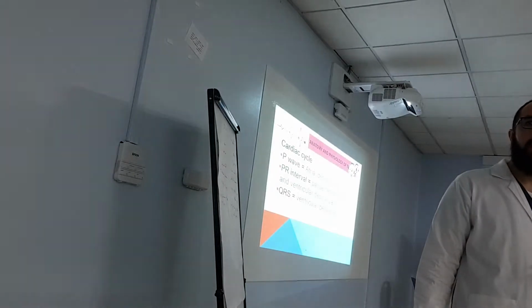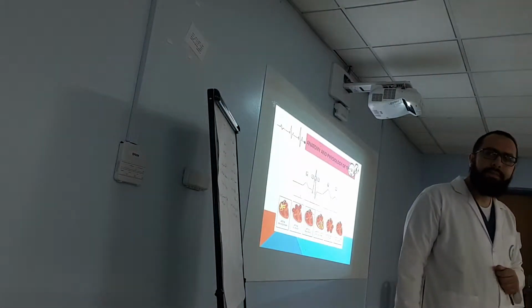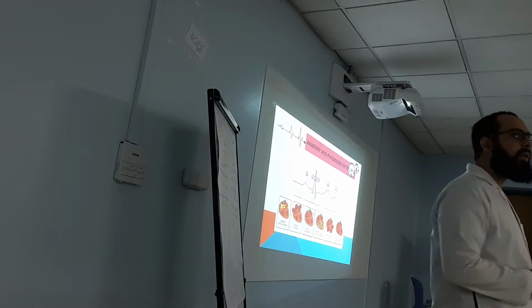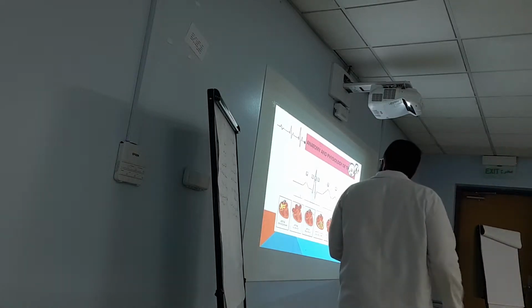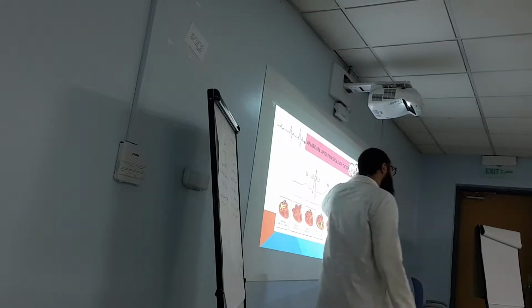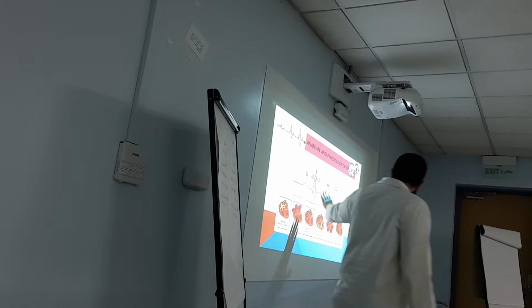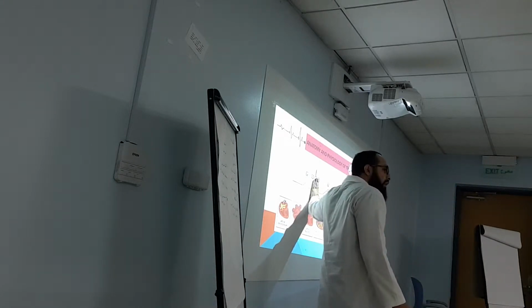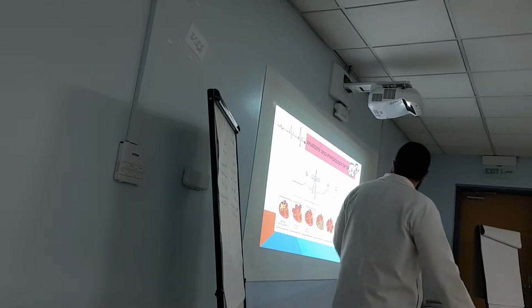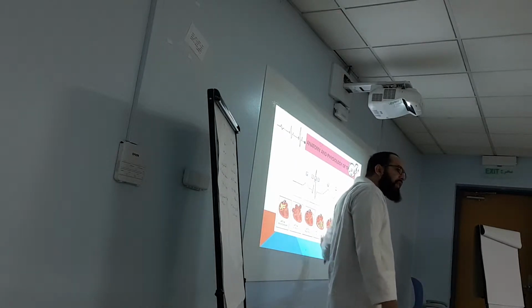Very rare to see it. So the cardiac cycle already explained by Mr. Eric. So why is it important? Because if I saw an abnormality in the P wave, I will suspect abnormality in the atrium. If I have abnormality in the QRS, abnormality in the ventricle. T wave also ventricle. ST segment, ventricle ischemia, okay?